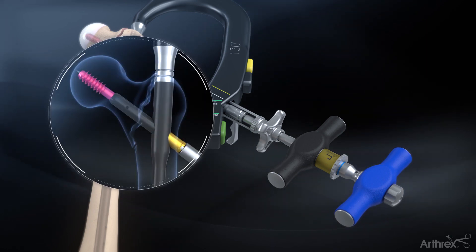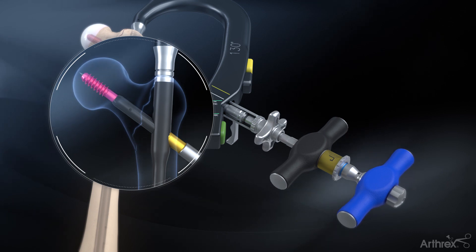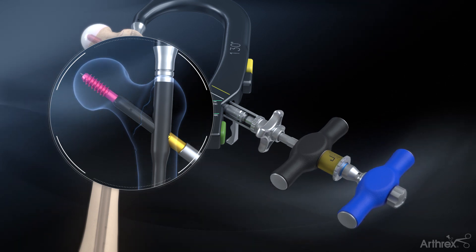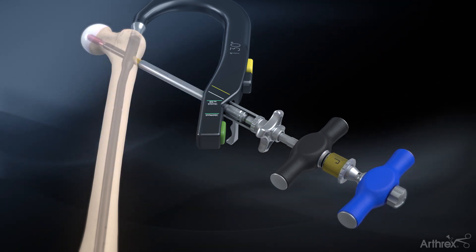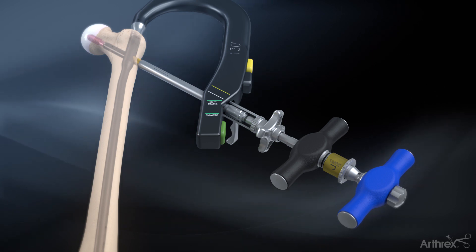For initial compression of the fracture, push the compression sleeve towards the targeting arm and rotate clockwise until the desired compression is achieved. Pull back on the gold knob and turn counterclockwise to disengage the blue handle and engage the black handle. The black line will now be showing.